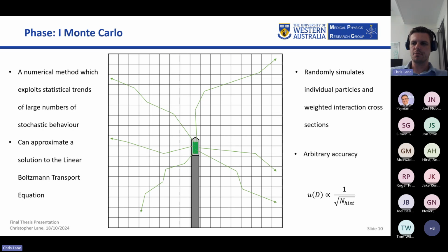So it's assigning a random point within the source cylinder. A photon is generated at a random angle with a kinetic energy that is determined by the weighted fraction of energy that can be emitted, and then it is emitted, and it will interact with the medium depending on the interaction cross sections, and the dose will be deposited accordingly.